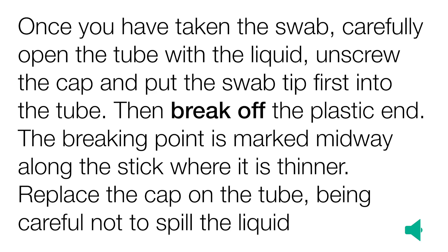Once you have taken the swab, carefully open the tube with the liquid in, unscrew the cap, and then put the swab tip first into the tube. Then break off the plastic end. The breaking point is marked midway along the stick where it is thinner. Replace the cap on the tube, being careful not to spill the liquid.